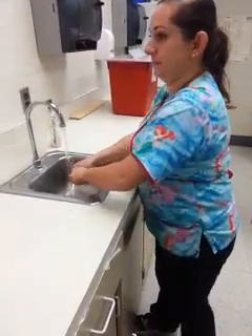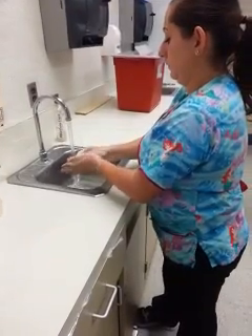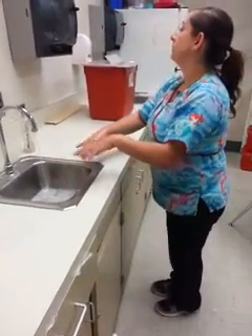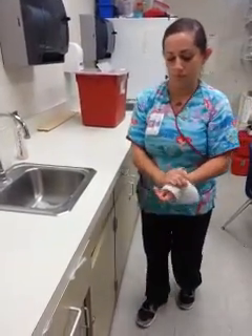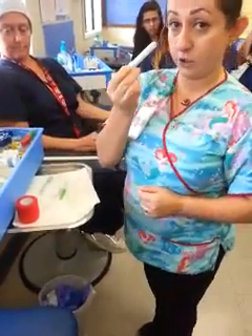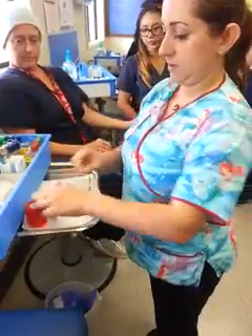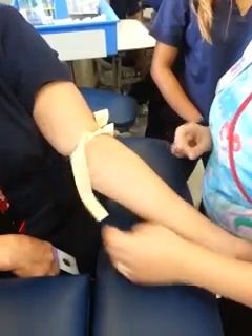You're going to wash your hands. The next thing you're going to do is set up a needle with safety, a tube holder without safety, a tube, an extra tube just in case, alcohol wipes, gauze, and coband. Then you're going to put the tourniquet on without gloves and palpate for the vein.